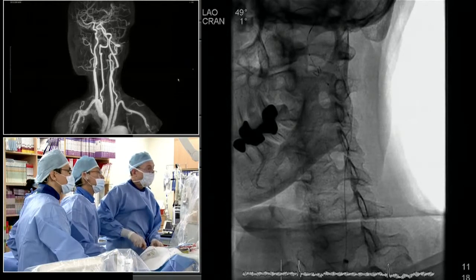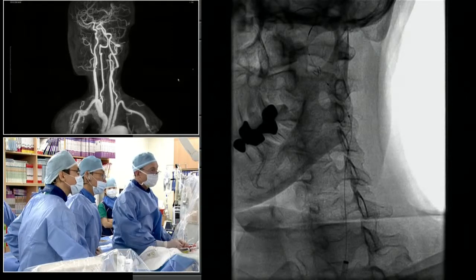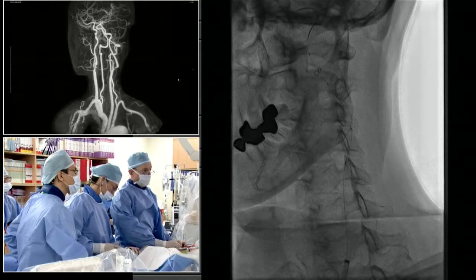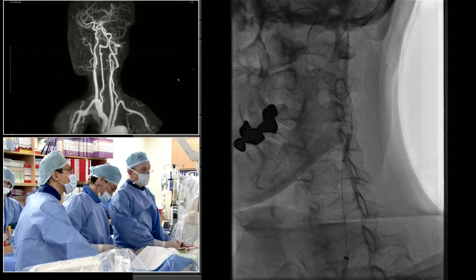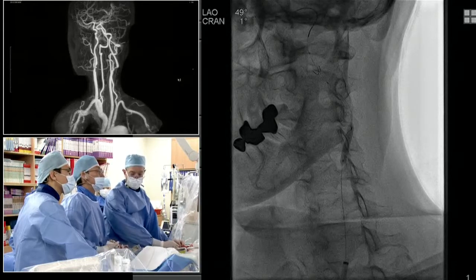There was a question about atropine, if you've pre-treated with atropine, or if you're thinking about that at this point. So we had that very discussion just before. I think we'll hit this one more time. Go up there to 6, please. We had that discussion here in the lab to pre-treat or not. Now, we typically do not in our lab. You can go to 8. Yes. Come on down. And then we'll take the stent.